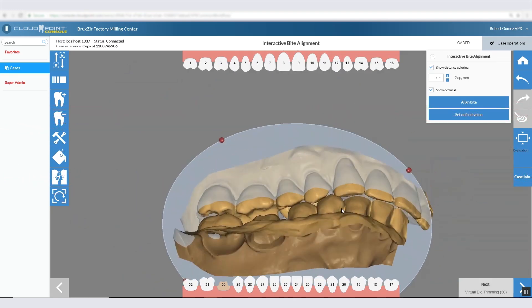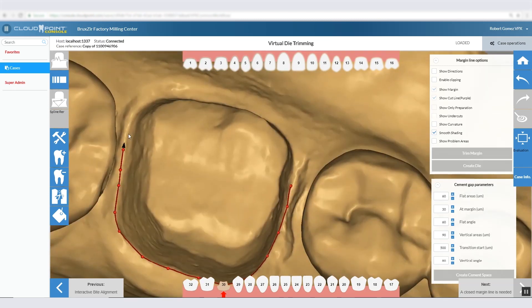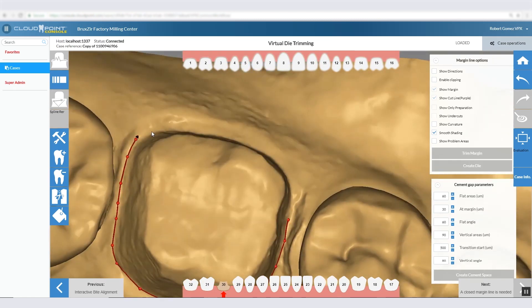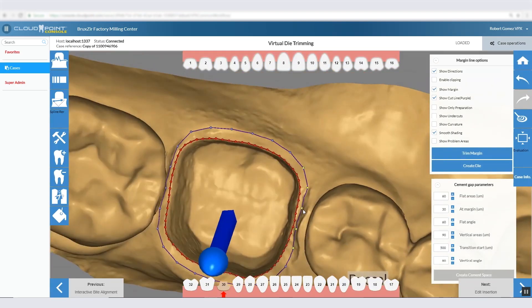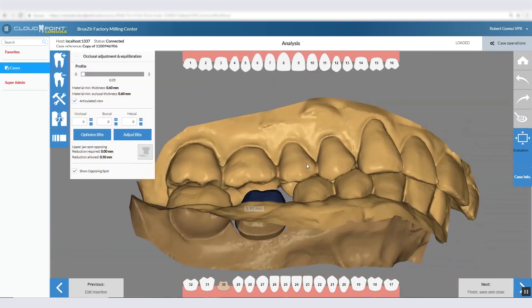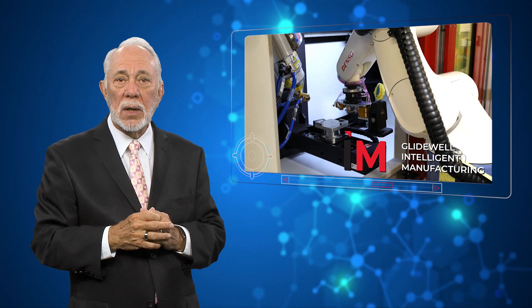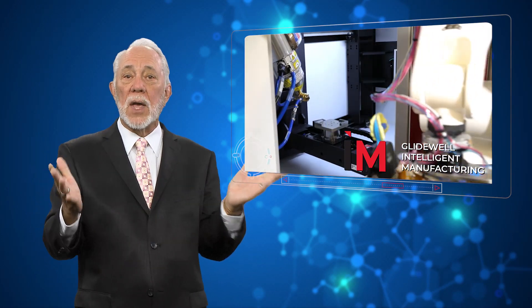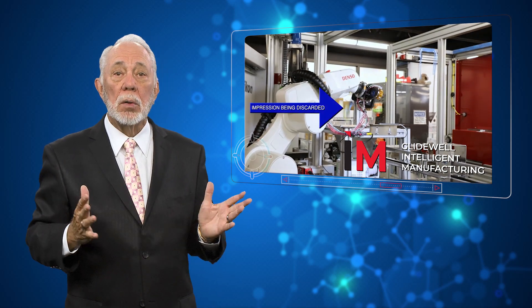Once we have that digital impression, we can replace the traditional plaster model process with our virtual plaster experience. Magnification tools at this step enable us to more precisely mark margins and trim the die. And if an error is identified, the user can simply undo and revert to a prior file state rather than having to retrieve the original impression and pour a new model. Digital file storage means we no longer need to retain physical impressions or study models at all, so potentially pathogenic surfaces and cross-contamination are all but eliminated.